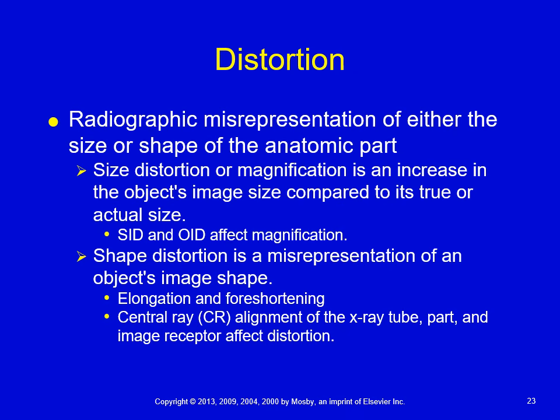So what I want you to think about really quick in terms of not properly aligned is when you're doing a chest X-ray. Visually, your tube is at 90 degrees and perpendicular to the patient, meaning it's shooting straight at the patient. The patient is flat up against the image receptor, and the image receptor is flat behind the patient. So everything is on the same line. If either of those parts are moved in an unnatural way, meaning not what the procedure called for to get that image, it will create some sort of distortion.